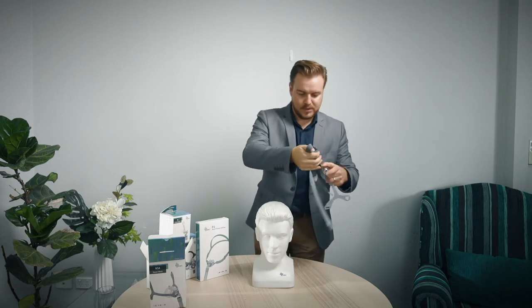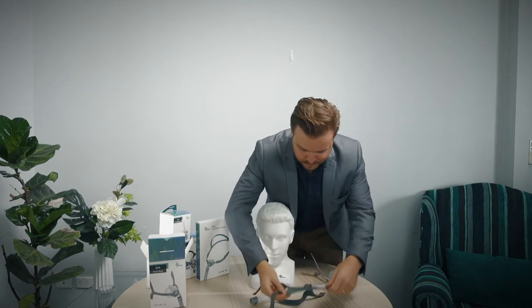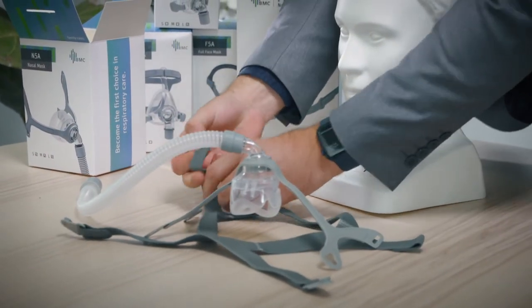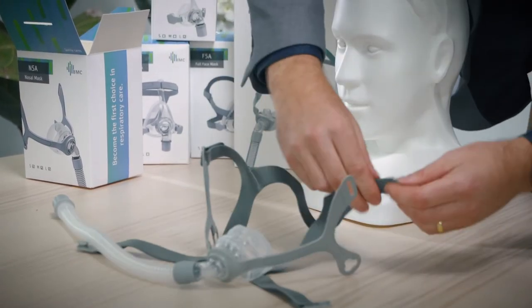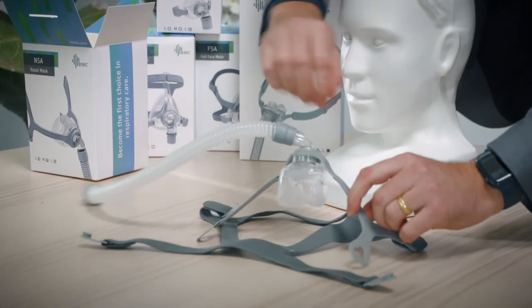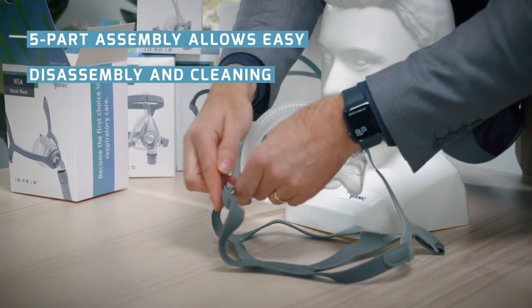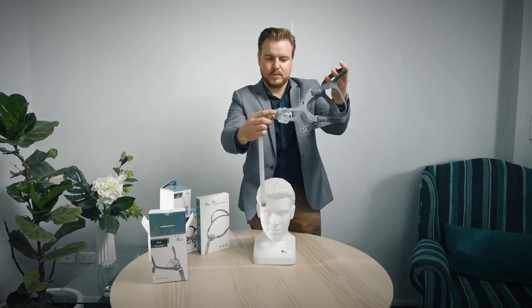For the headgear, to fit it just lay it out on a flat surface like so. Place the mask in the center. You want the velcro parts at the top of the mask where the point is, and then these clips down the bottom, and then push in like so. Overall the mask looks like that.